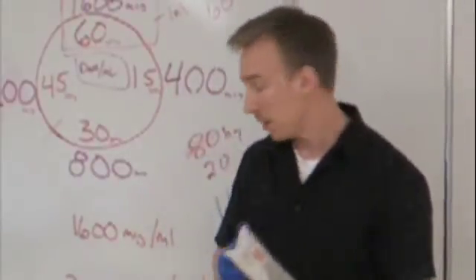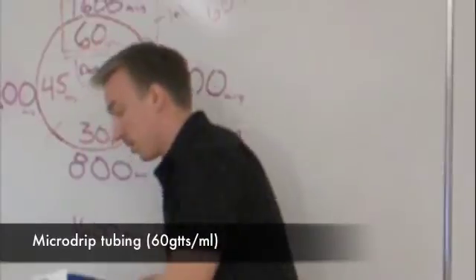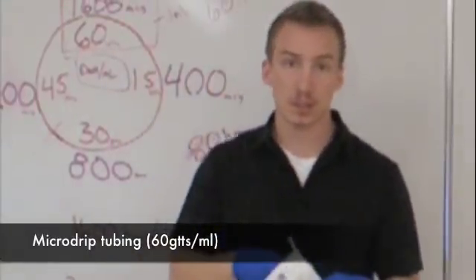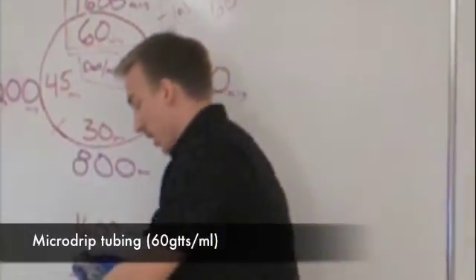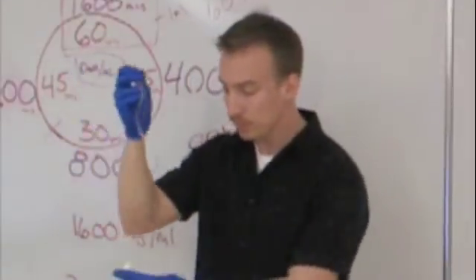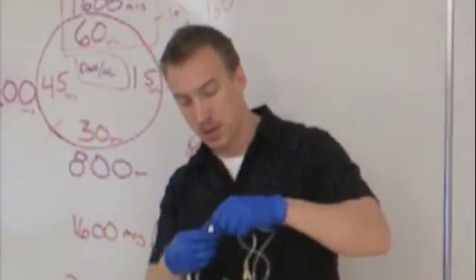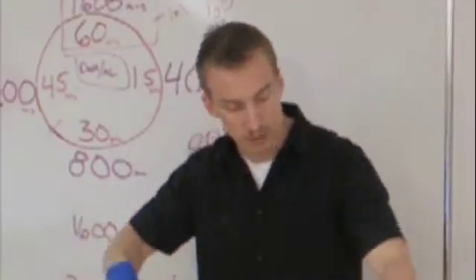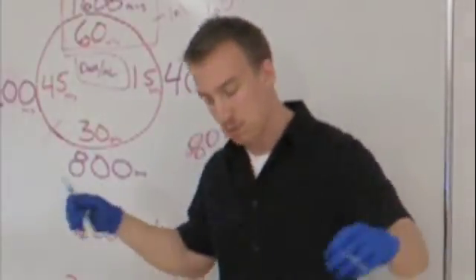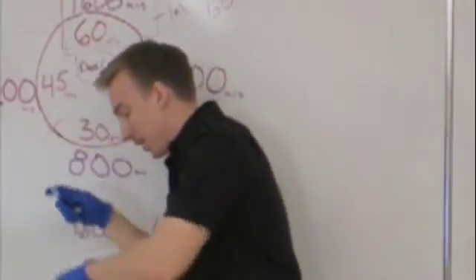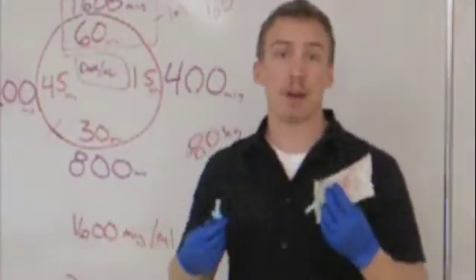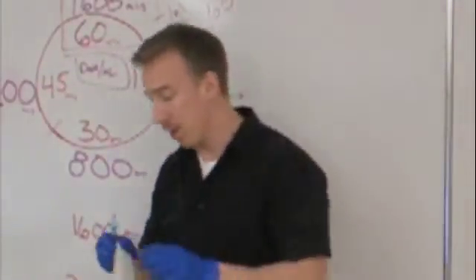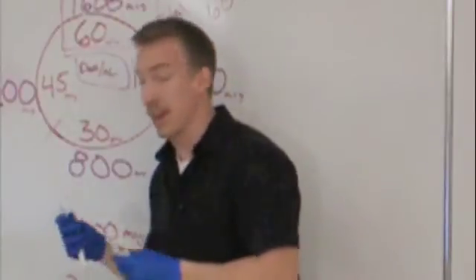...and when we're finished, we're going to document it correctly. We're also going to take our micro-drip set, and unpackage it, and wheel the clamps, and make sure your tubing is untangled. Now, setting this up is just like setting up an IV bag. So remember, this needs to stay sterile.